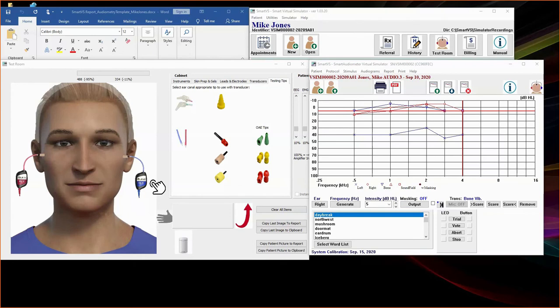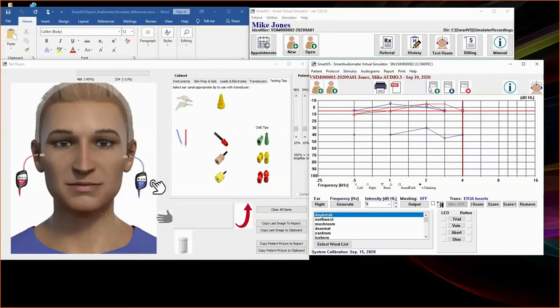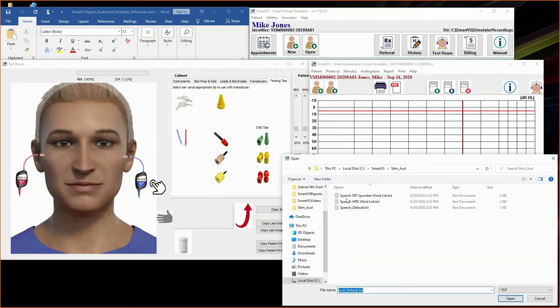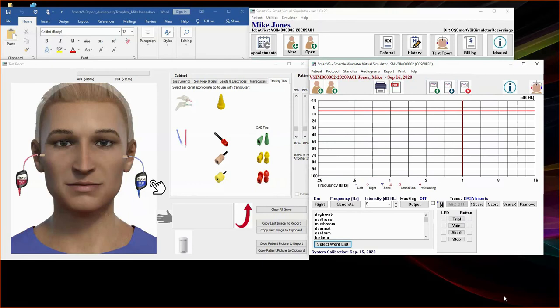To proceed with speech testing, I have returned the bone vibrator back to the instrument cabinet. Let us now set our simulator back to insert earphones via the stimulus menu and use the clear audiogram button to clear the audiogram. We will begin with speech recognition threshold. If a patient does not understand a word, you will see a question mark. Otherwise, they will respond with the word they understand. The system defaults to the Spondee word list, but just to verify, you can click on select word list and load the SRT Spondee word list by clicking, selecting, and clicking on open. We will use a down and Minnard method for attaining an SRT, presenting a Spondee at the lowest audiometer setting or 0 dB HL or 30 dB below the known pure tone audiometry threshold.